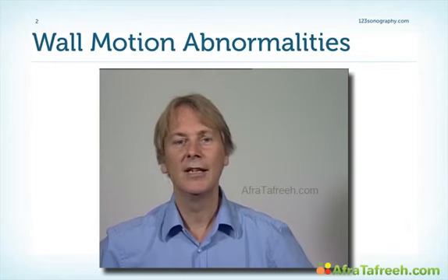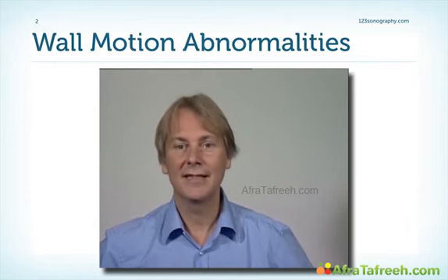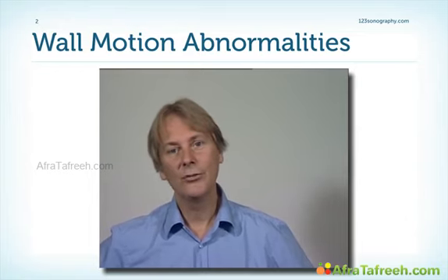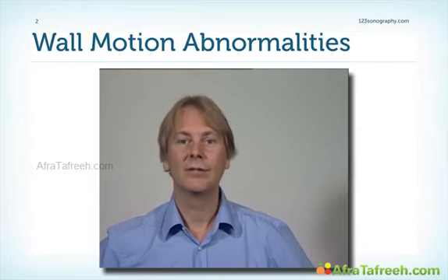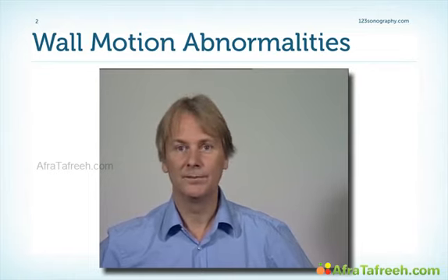And I was always wondering, what is he actually doing? Is he guessing or what? Well, I guess he was guessing in a way, but he was making very good guesses actually. So he was right most of the time. In any case, what I learned was that the eye has to be trained to assess regional wall motion abnormalities. And this I will try to teach you.